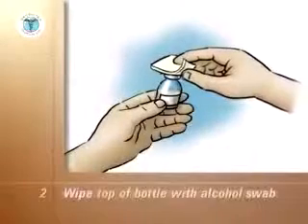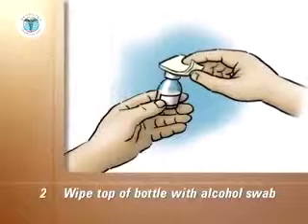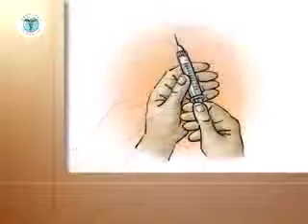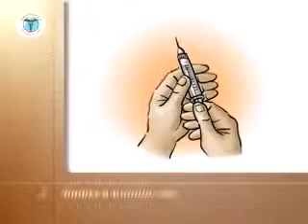Wipe off the top of the bottle with an alcohol swab. Discard the swab. Pick up the syringe and remove the needle cap.